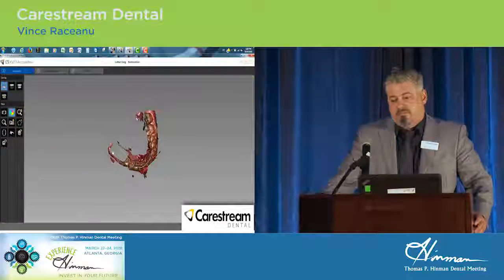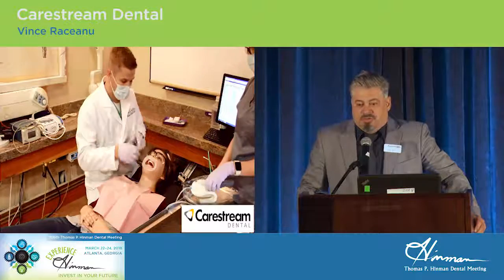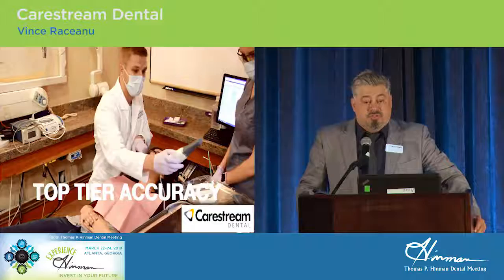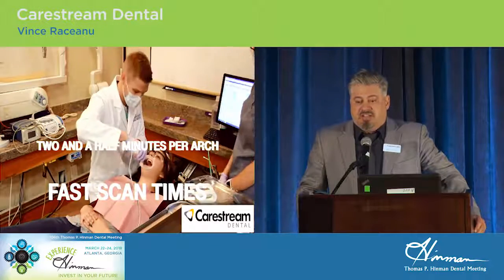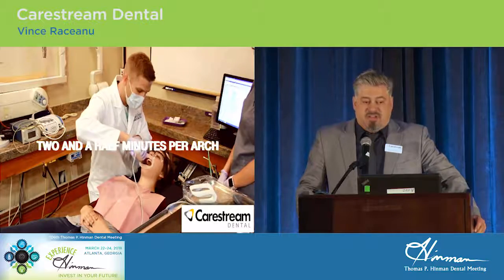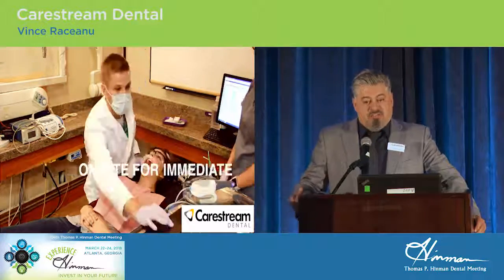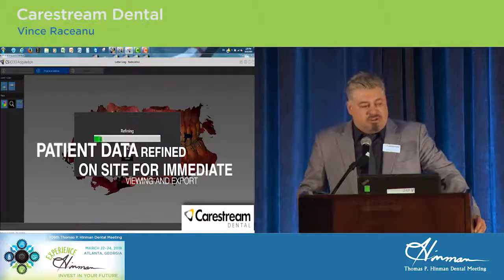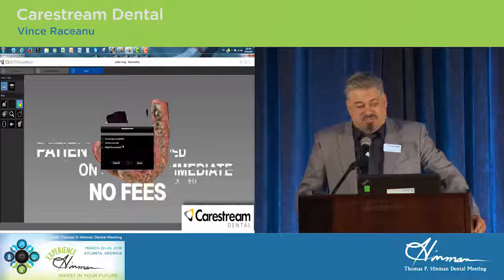So what they're doing here, one of the preferred workflows is to scan the quadrant or the arch prior to the tooth being prepped or teeth being prepped, and then having basically the entire impression be done while the patient is numbing, so that when you come back in the room and actually prep the teeth, you're able to only scan the prepped teeth, and they're being dropped into that same arch that was previously scanned. So that's what this is demonstrating.